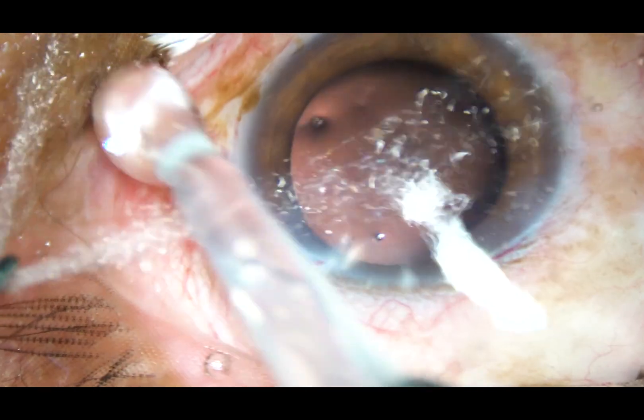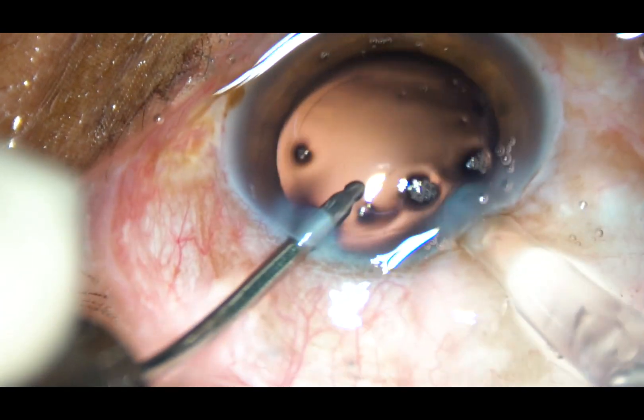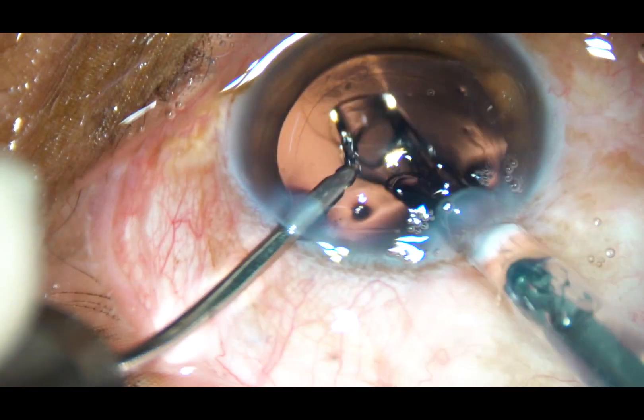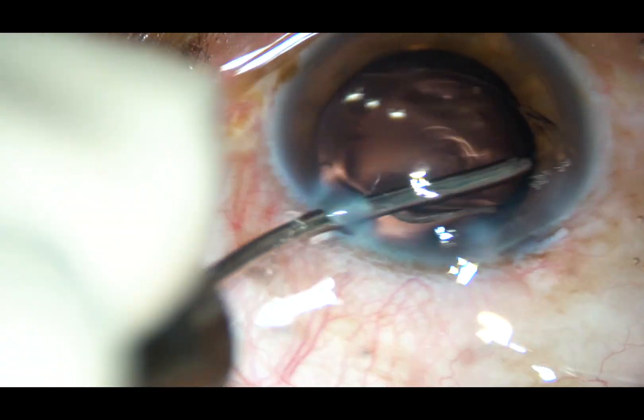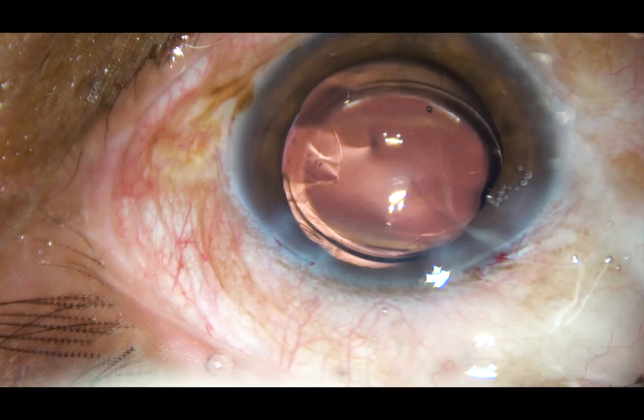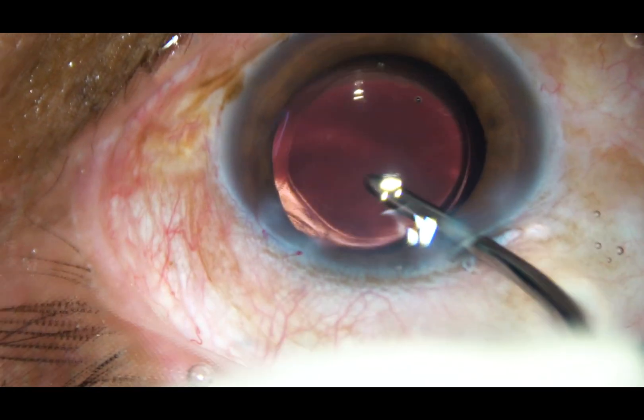Now the intraocular lens is inserted. The lens is to be placed in the capsular bag. The leading haptic goes into the back, and with a nudge of the left-hand instrument, the trailing haptic also goes into the capsular bag.